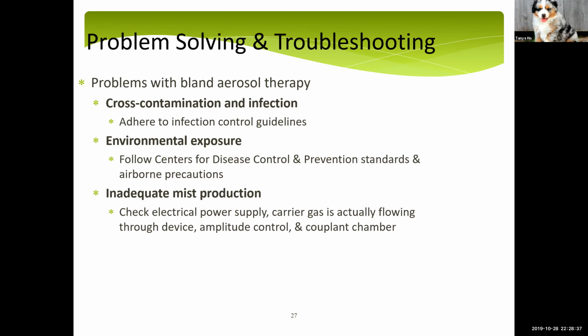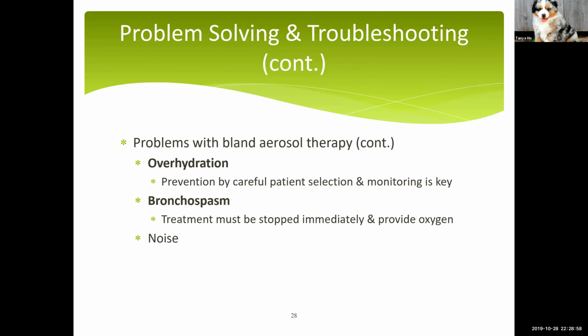Okay, so some problems with aerosol therapy: infection is a big one. And then if it's just not working, so you have to check your connections and make sure that your device is putting out mist. And then the other thing would be noise in terms of compliance. It could be noisy, and then the patients complain that they can't sleep. Another problem is overhydration, because it's water particles. You could overhydrate somebody, and then again, bronchospasm.